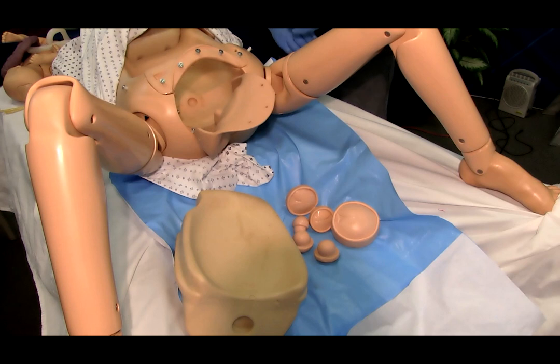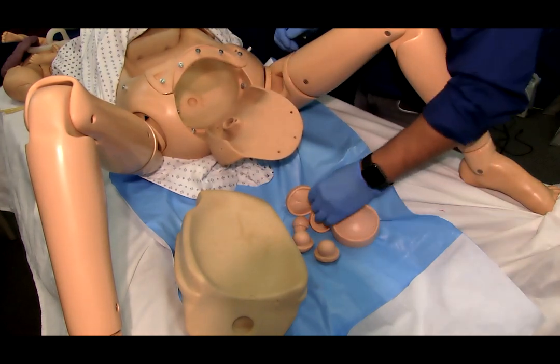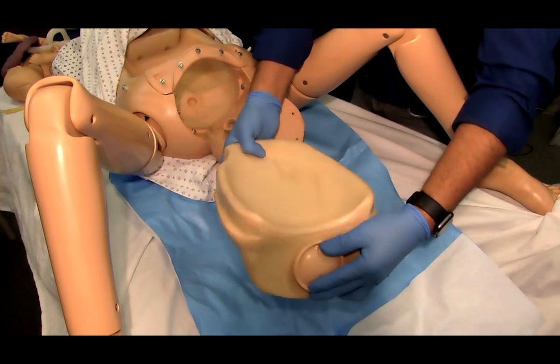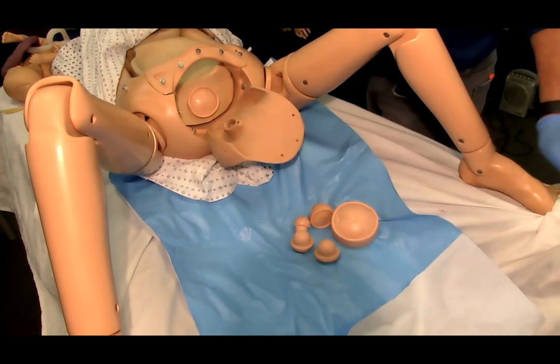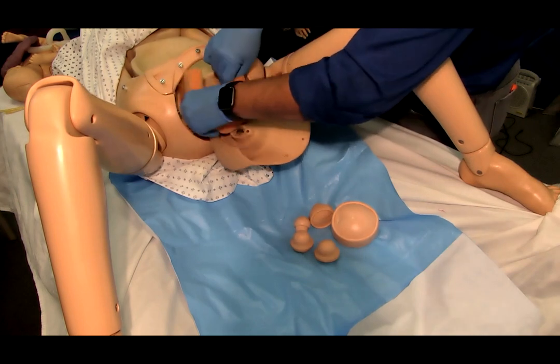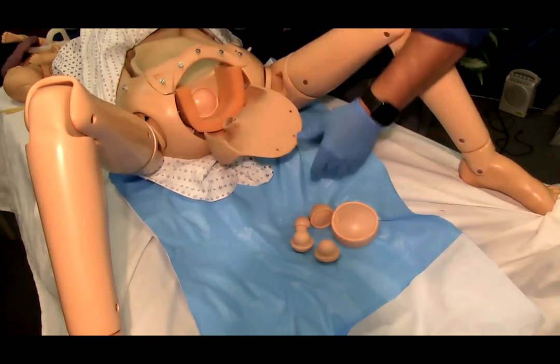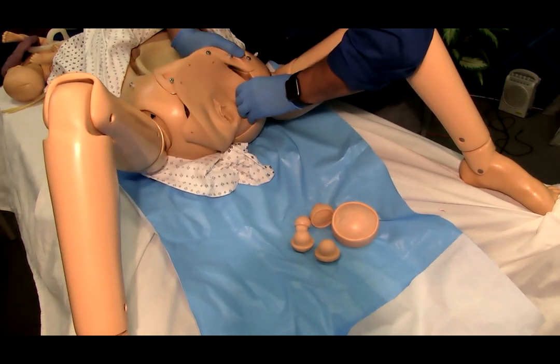To set up cervical dilation and effacement, select the desired cervix module and plug it into the receptacle in the pelvic block. Place the pelvic block in the torso. Position the genital foam stabilizer pad in a U shape between the block and the skin. This will prevent excessive movement of the skin during examination. Attach the prenatal perineal skin.